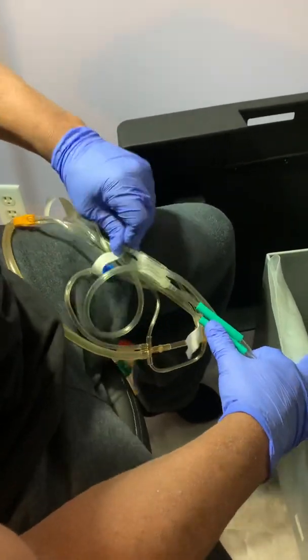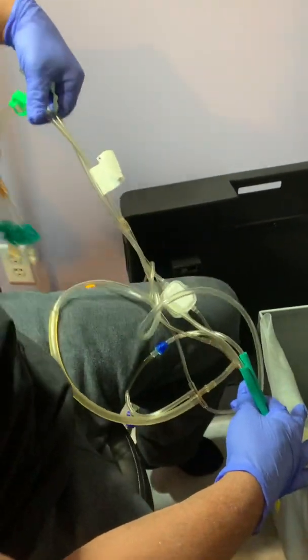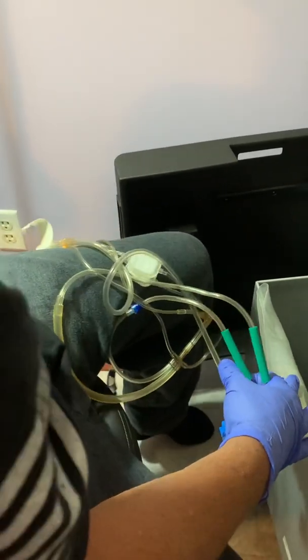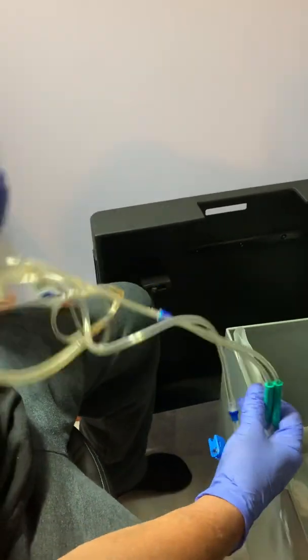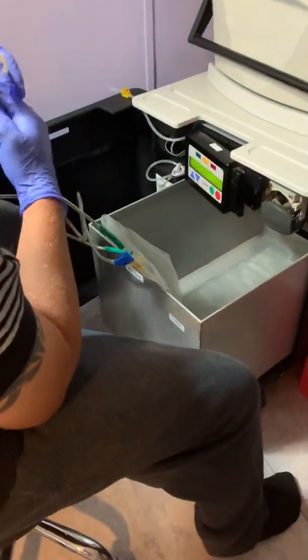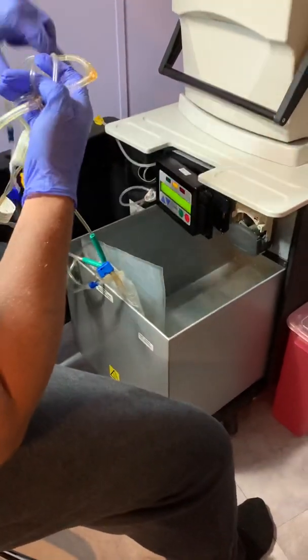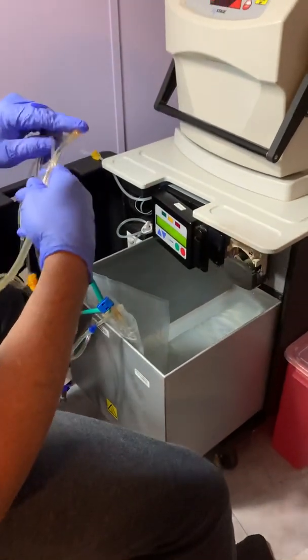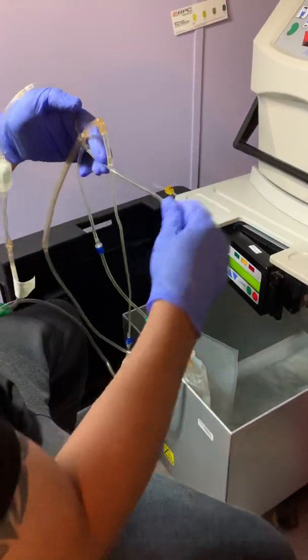Then you gotta take off all these little tabs right here. There's only two tabs on there. Throw those away. Try to untangle all this mess. Prior to us ever touching our cycler or our PureFlow, we wash our hands for a full 60 seconds, sanitize, and put gloves on. Then I usually just throw sanitizer on my gloves just to make sure.